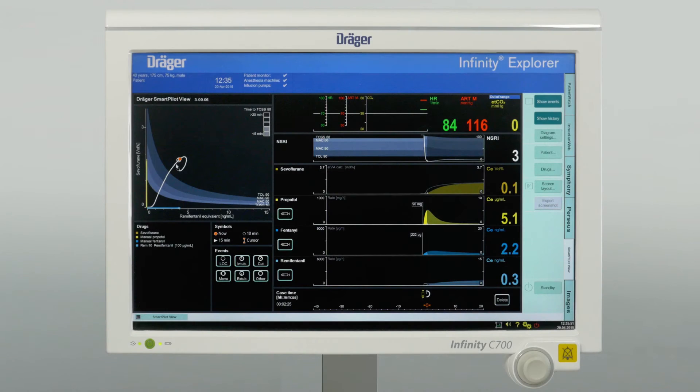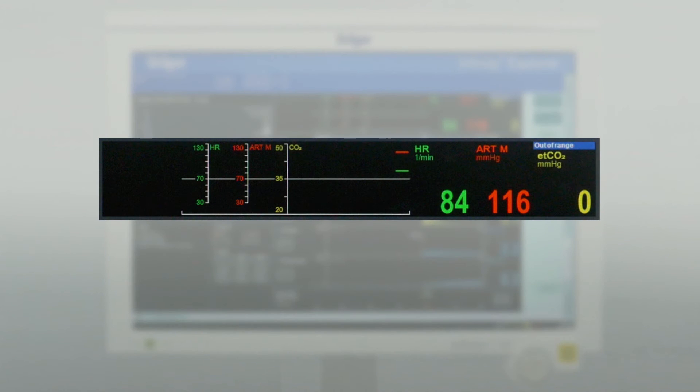Next is the Noxious Stimulus Response Index. NSRI represents the probability of a reaction to a certain stimulus, displayed on a timescale and as a numerical value from 0 to 100. The lower the NSRI value, the deeper the anesthesia. The upper part shows vital parameters from hemodynamic monitoring, such as heart rate, blood pressure, end-tidal CO2, and optional BIS index.